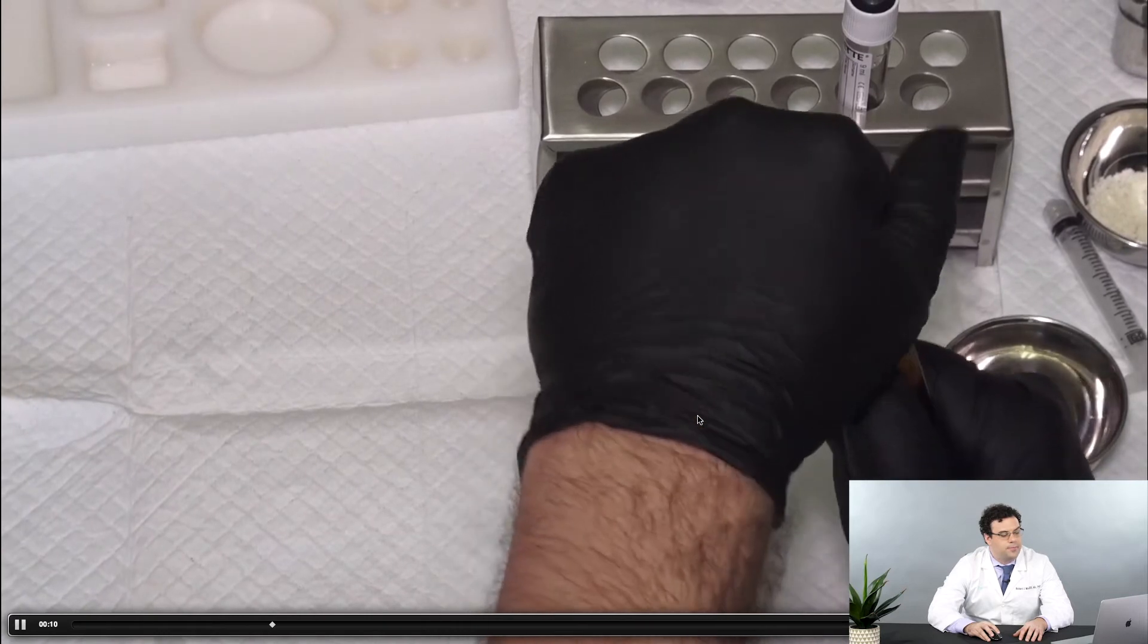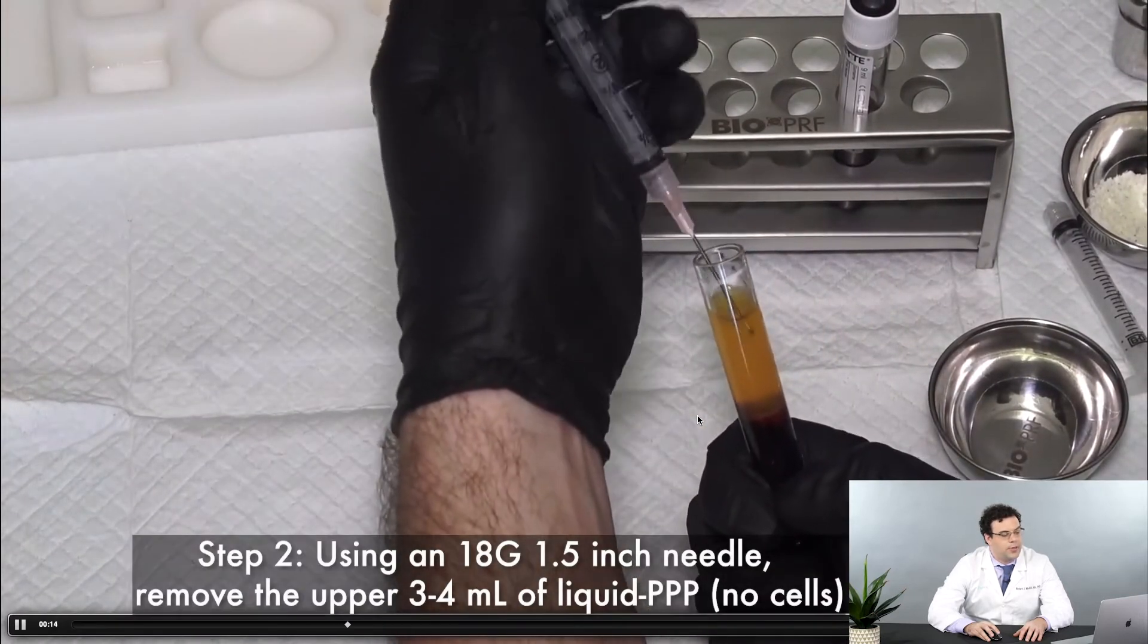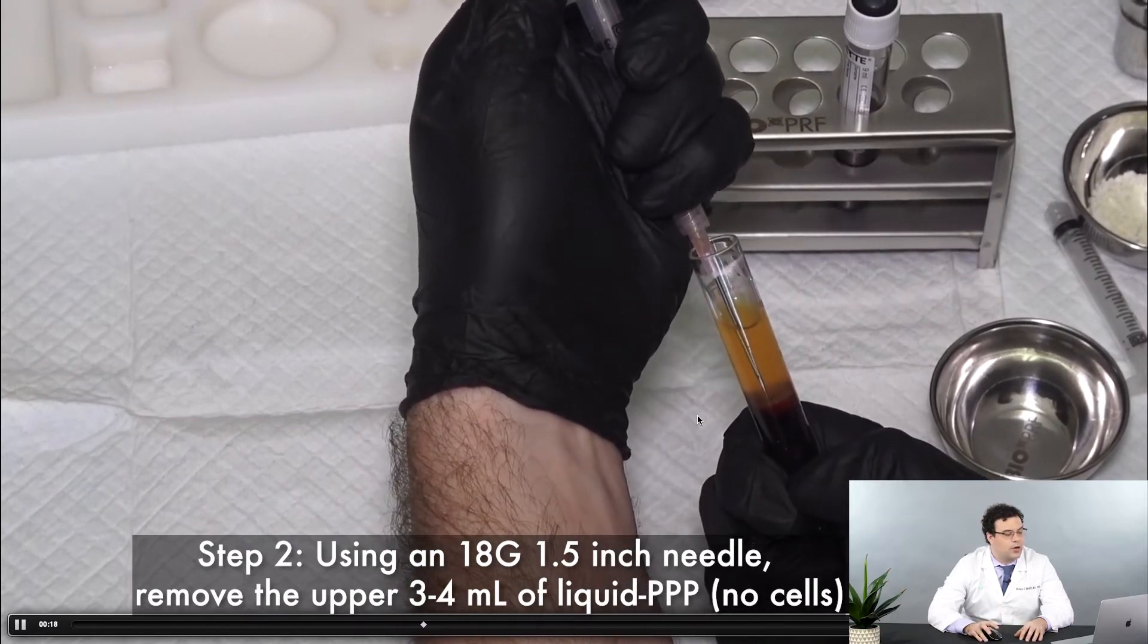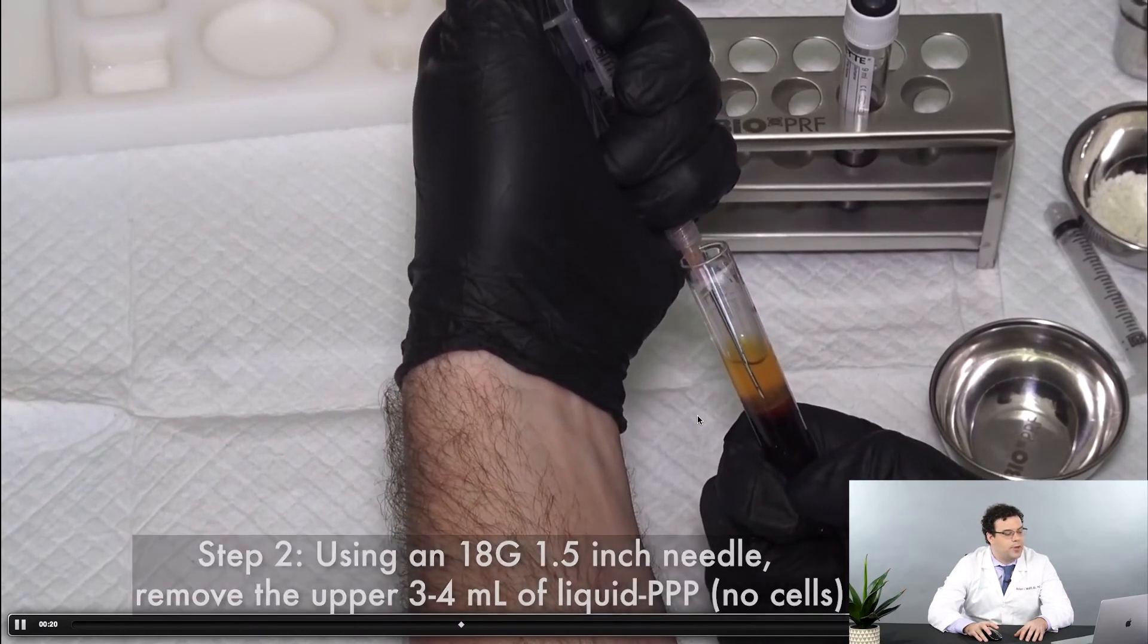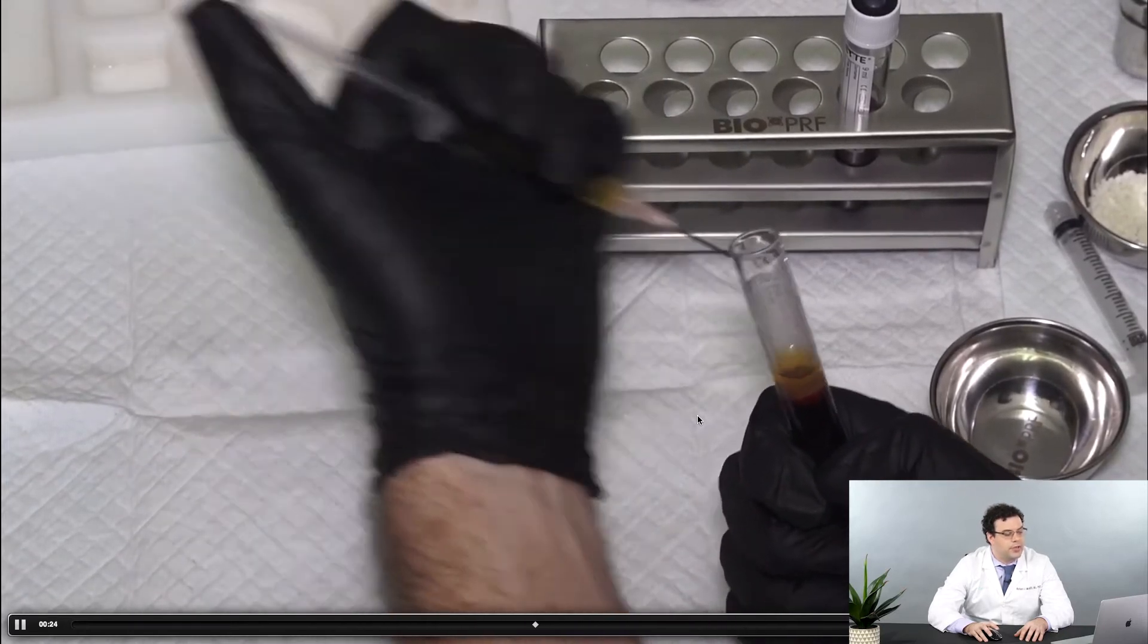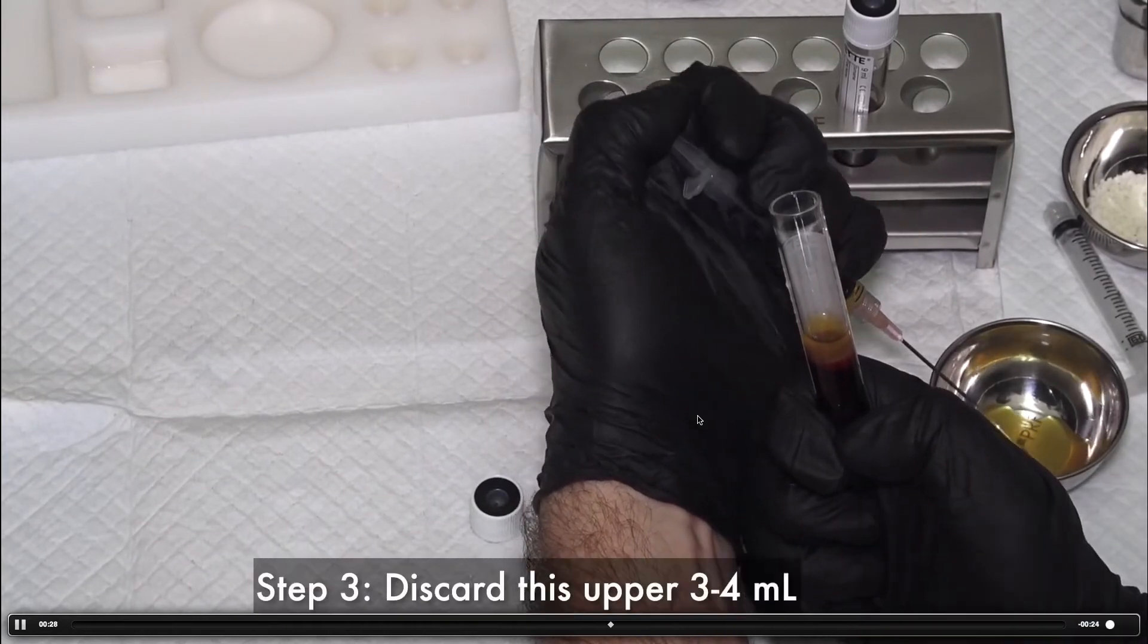We're going to pop the lid. And I actually learned this technique from the PPP, PRP experts, and this was Dr. Roon Garg. I saw him doing this one time with PRP and I said, that's how everybody should be doing it, even with platelet-rich fibrin. And so I have to give him credit, of course, for the technique.